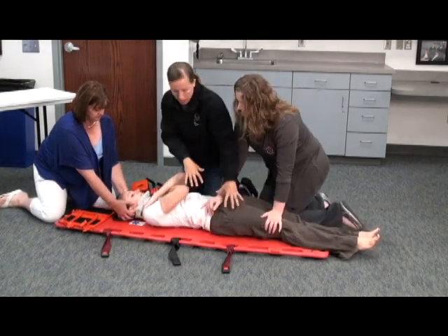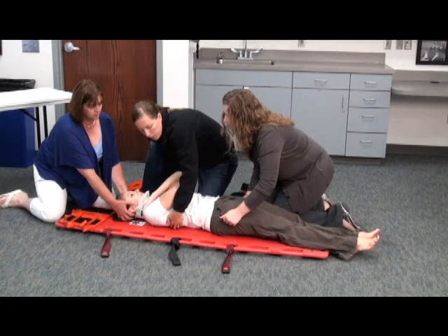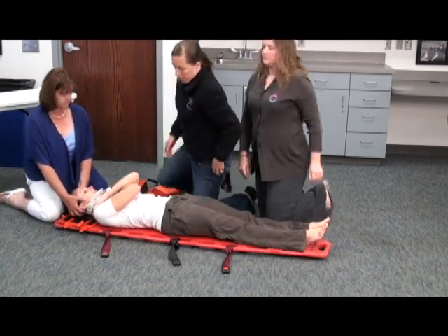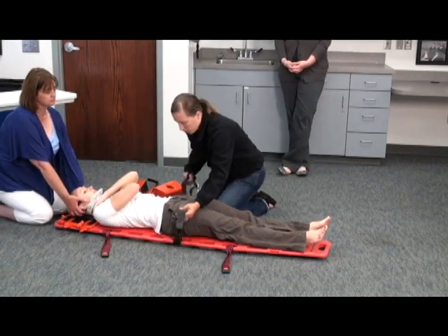We're going to position the board appropriately. And on her count of three, we'll roll back. One, two, three. And now we need to move her up as a unit, up and over. If you want to grab the hips, I'll grab up here at the torso, and on her count of three, we'll move up and over. One, two, three. At this point, I'm going to check and see if she needs any padding behind her torso. If she feels okay to me, I'm going to secure her to the board.